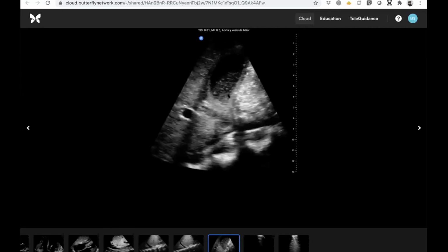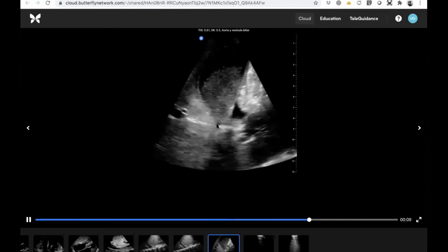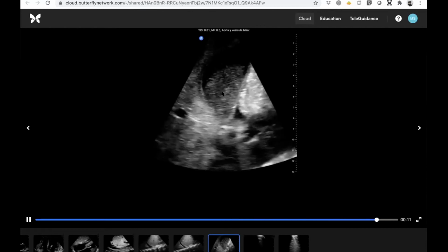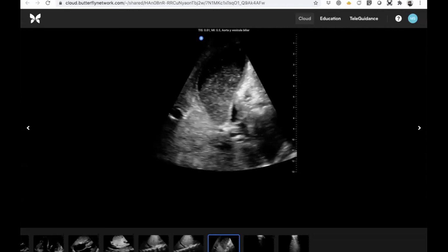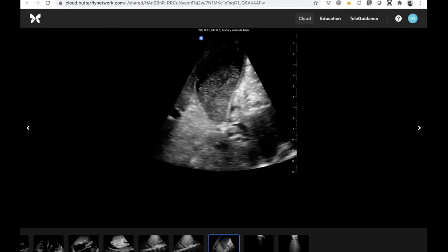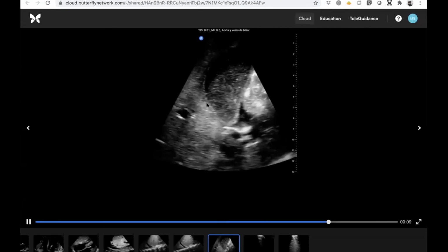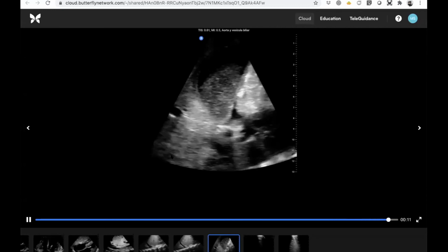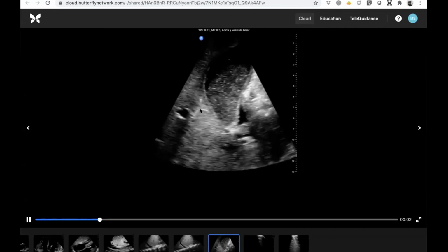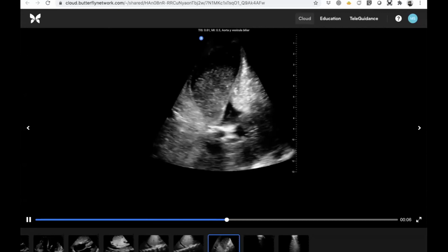Yeah, so we've got echogenic material within the gallbladder lumen. It isn't shadowing, which is why Rachel's calling it sludge as opposed to a stone. There's also the same phenomenon we saw with the bladder, just to wrap up and reintroduce that same theme, which is the echotexture of the liver here. It's brighter deep to the gallbladder than it is adjacent over here.